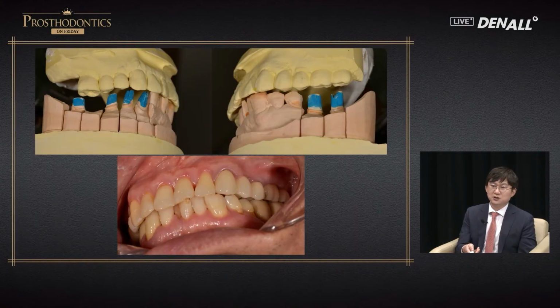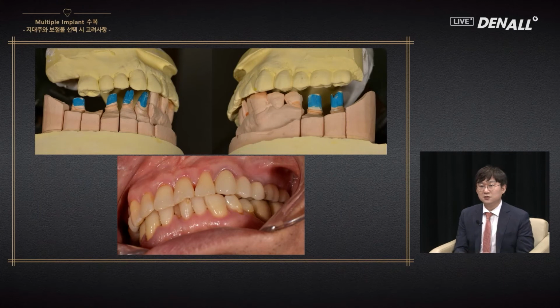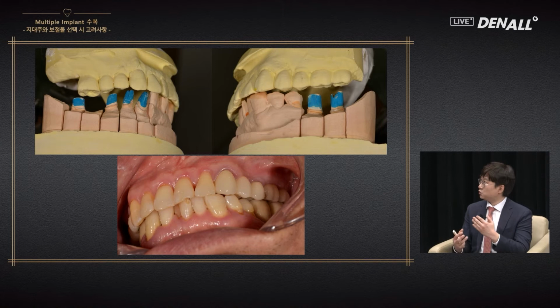When a patient has a fremitus, in this case, let me go back. This region, the abutment level impression is taken. This area will be restored. The anterior teeth have labial version as it touches the premolar while chewing. If you restore at that height, fremitus, the TFO would not disappear in the anterior region.